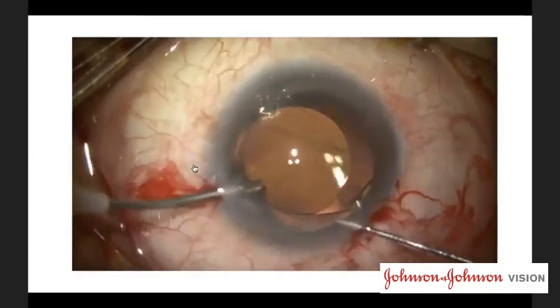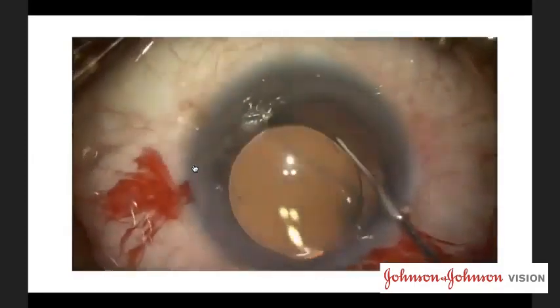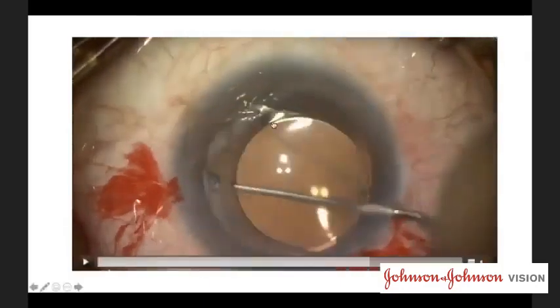They go in from the side port. I move the lens in place. Now this is a single piece lens. Just watch. This is a single piece lens. There is a CTR in place. Now single piece lenses are very difficult to capture because the haptic optic junction can bend. So you have to be very careful.